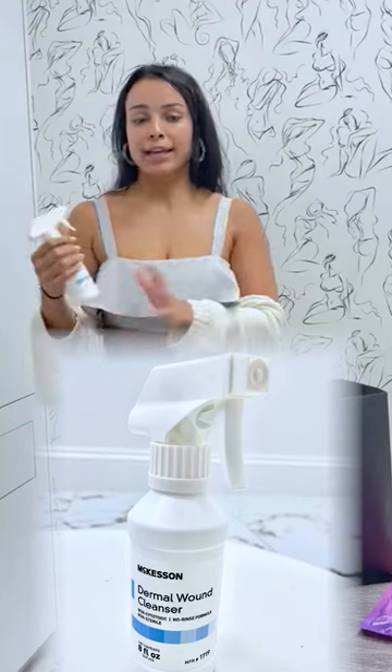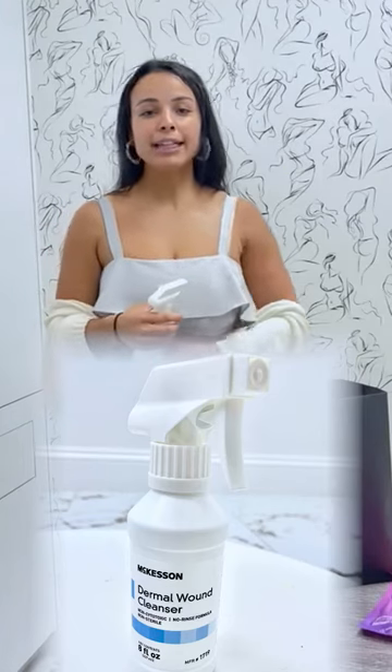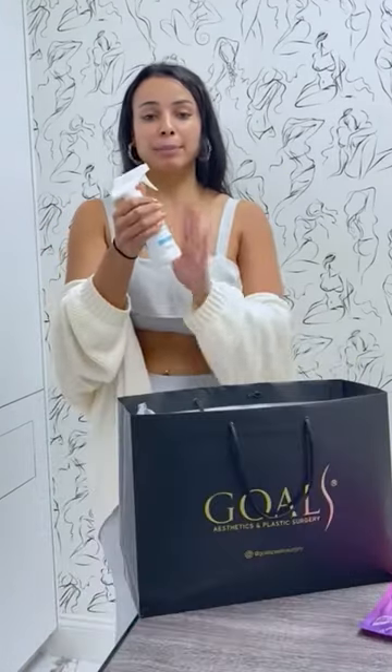After that you have a wound cleanser. All you need to do is spray your incisions, any cuts you may have, and this will keep it sanitized and healthy. You don't need to worry about rinsing it or wiping it off — after you put your faja back on, you could put it right back on after you use this.